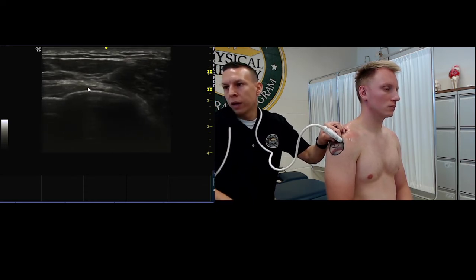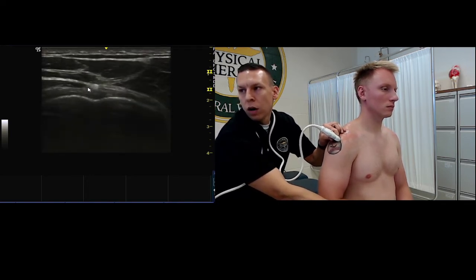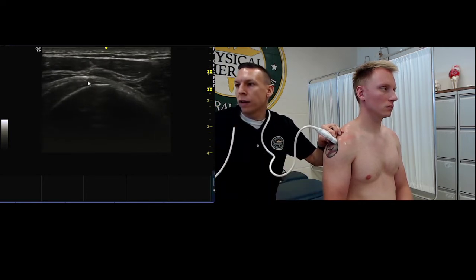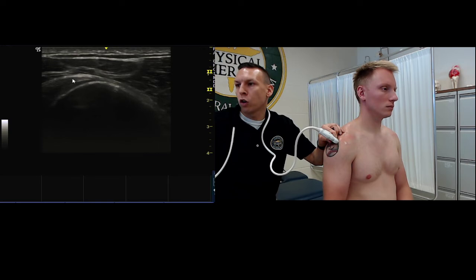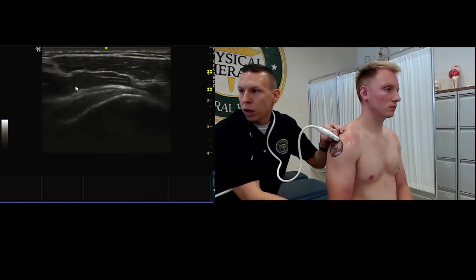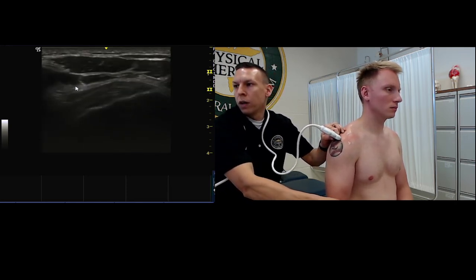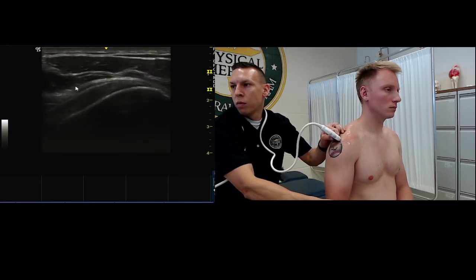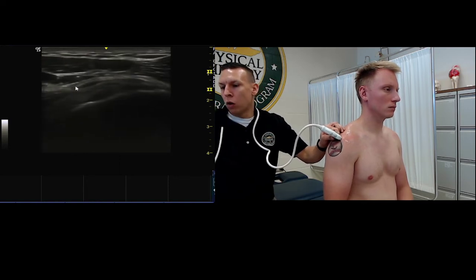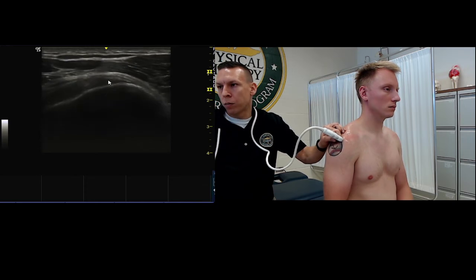From here, we can also take that shoulder and move them into internal and external rotation to look at the infraspinatus tendon attached to the humerus. You can also here do the same thing where you have them hold there, don't let them move you, and do a little bit of a stress in long axis. So you can do a couple different movements here, and you want to slide the probe up and down, or cephalad and caudal, on that tendon to visualize the entire footprint of the infraspinatus.